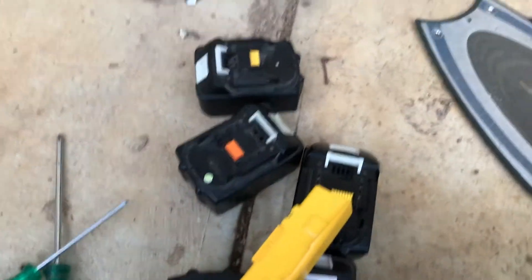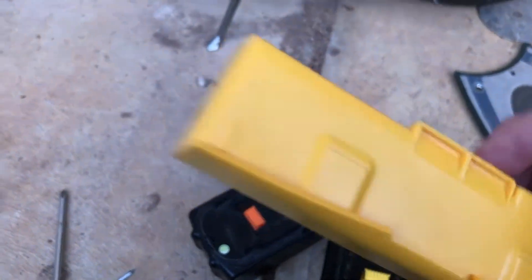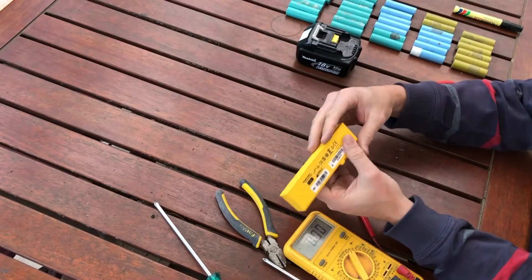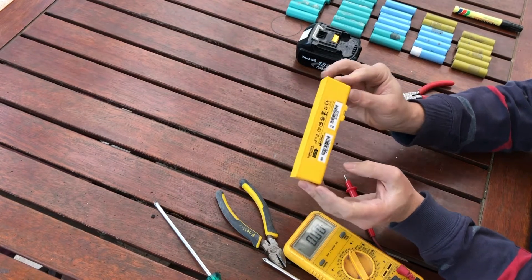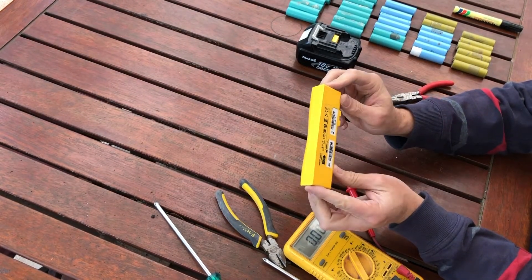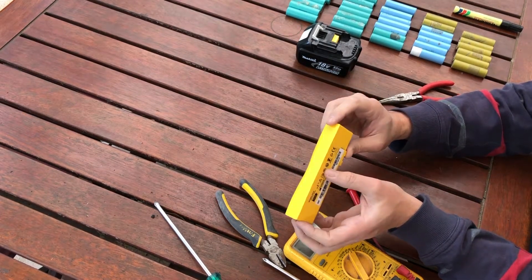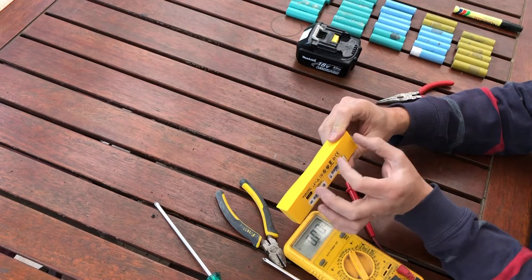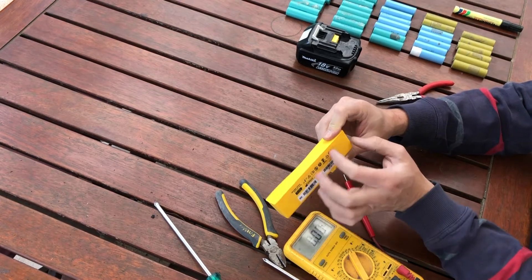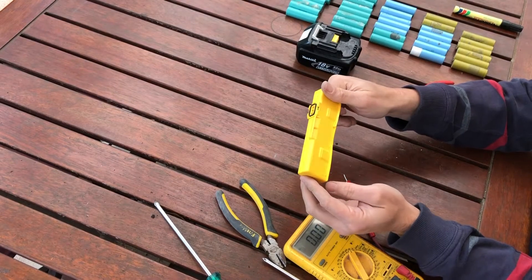Hello everybody, and welcome back to the channel. Have you ever wondered if the lithium batteries inside an expired defibrillator battery pack would be useful for a DIY project? In this video I open up a Defib Tech Lifeline View lithium battery, model number DBP 2003, and show you what's inside. I'm going to guess maybe there's four cells like these ones — let's see if we can get it apart.